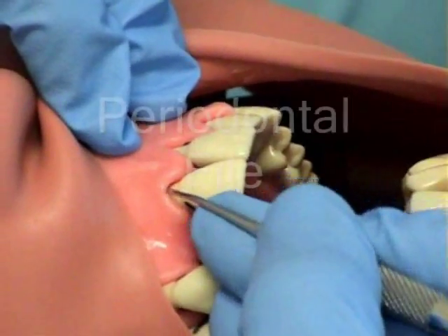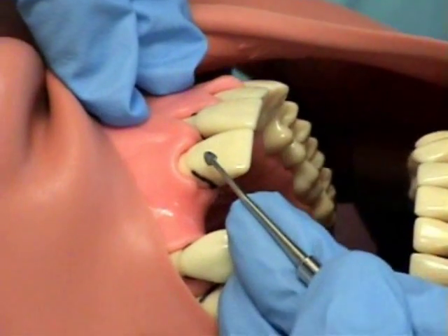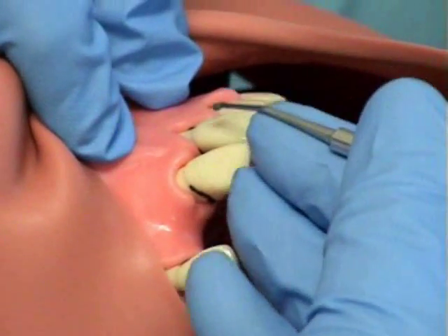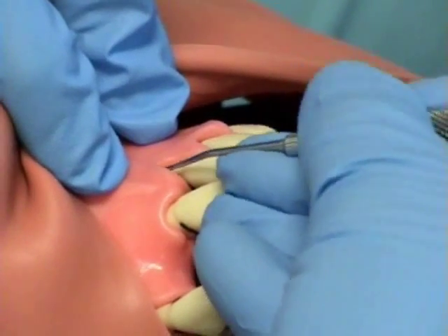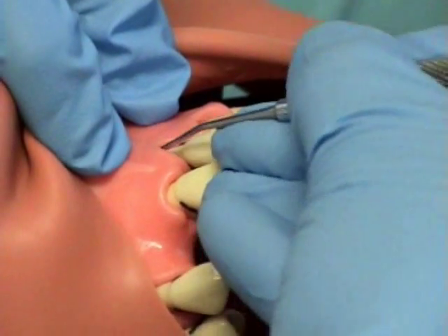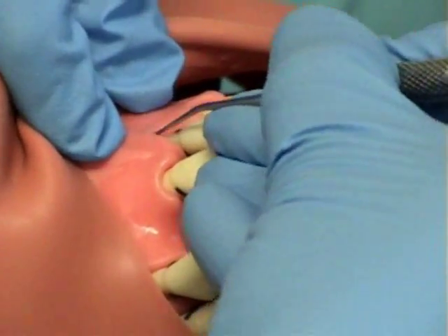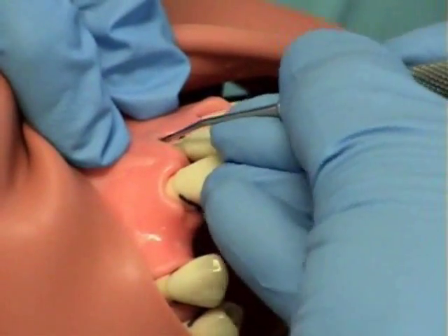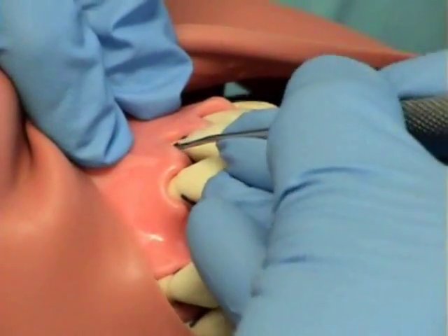A periodontal file has multiple cutting edges. It is like a series of hoe scalers. Each blade is at a 90 to 105 degree angle to the shank. The shank comes in various angles. Curved shanks are designed for posterior and straight shanks are for anterior. The purpose of a file is for calculus removal through crushing or fragmentation, and definitive scaling is followed with curettes.